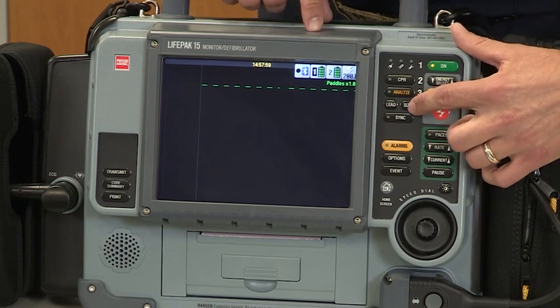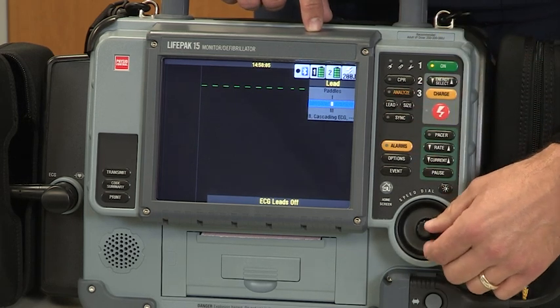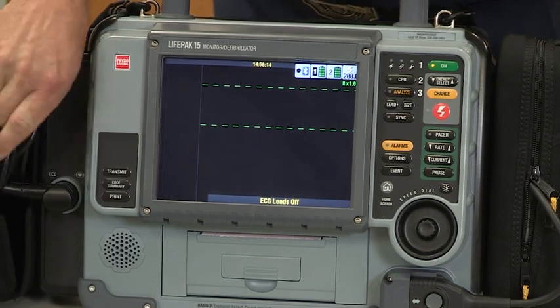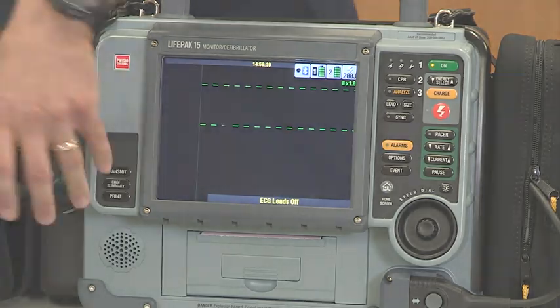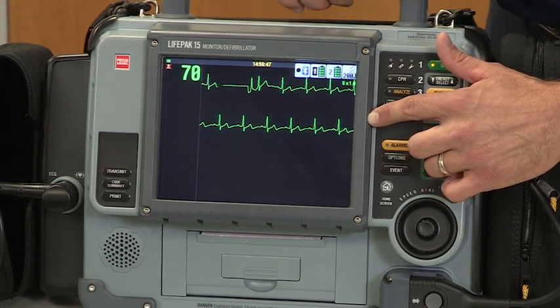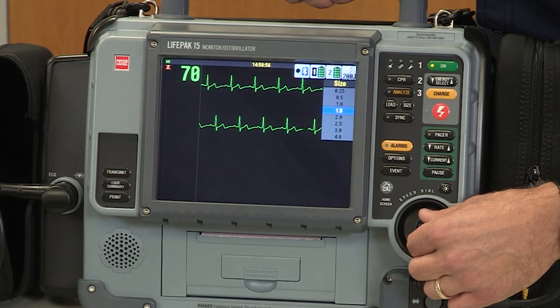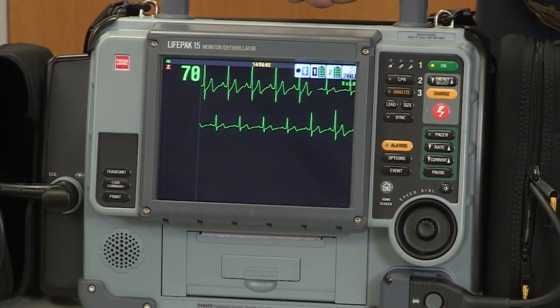So to change that, you just slide over to the lead button, depress the lead button, and then use the speed dialer to scroll down to the cascading EKG. Depress it once, and it will select the cascading feature, which will give you 2 lines to look at. So now that we're in the 3-lead monitoring option on the LIFEPAK 15, we can increase or decrease the size by simply pressing the size button, using the speed dialer to increase the gain, and if you want to keep it there, just depress the button in the center.